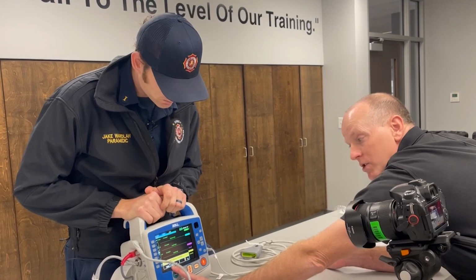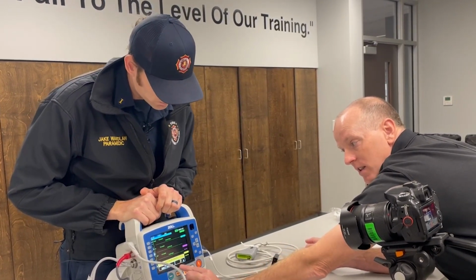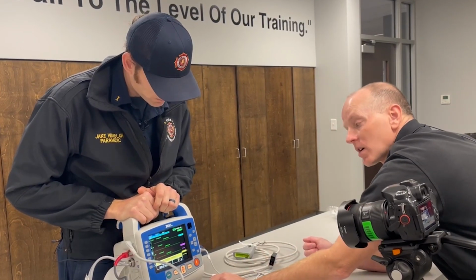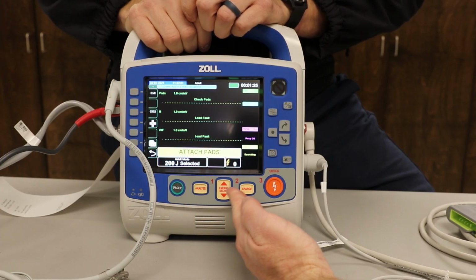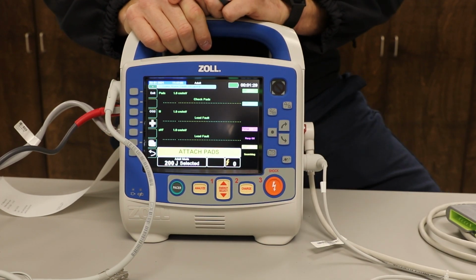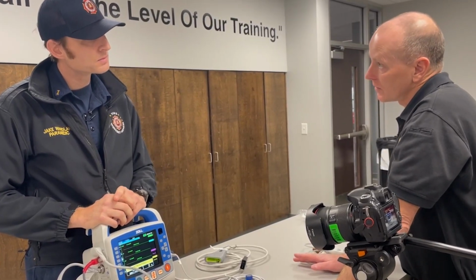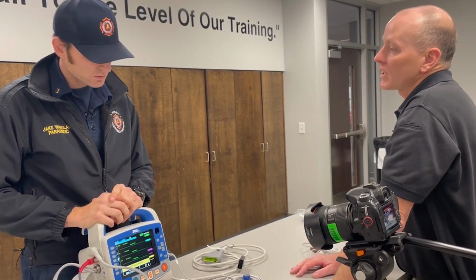The anterior posterior placements will then decide what joules. So then it's as simple as this is analyzing once I turn the pads on, and then it's going to be going through 2, 3, charging it, shocking it, correct? Correct. But if this is a pediatric, and let's say we don't do anterior and posterior placements, how do I make this a pediatric AED?